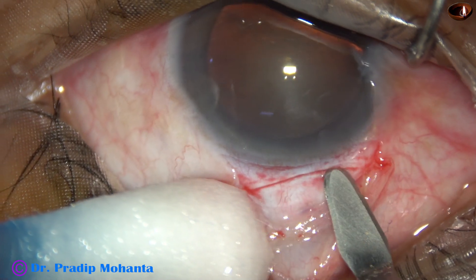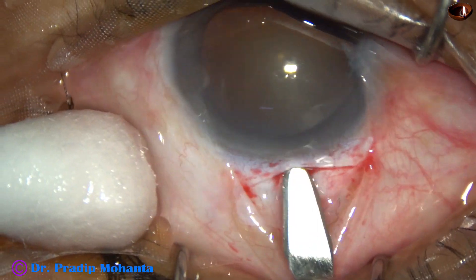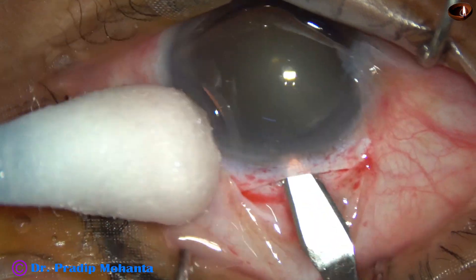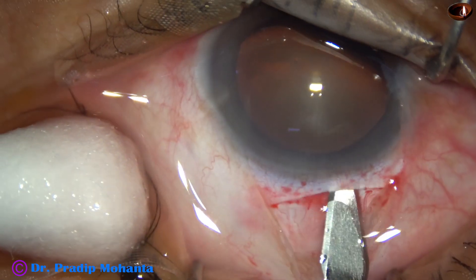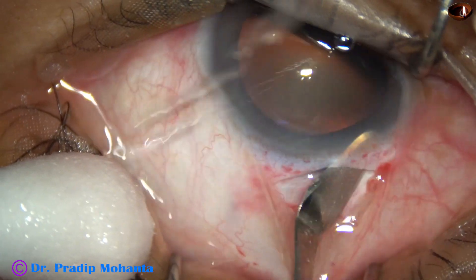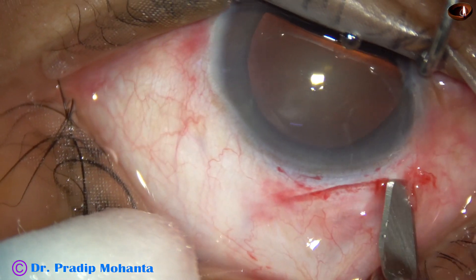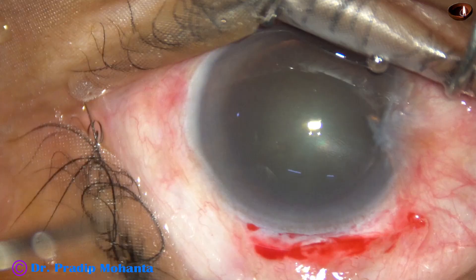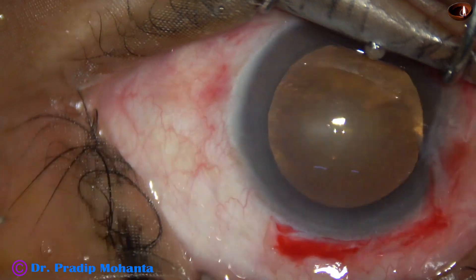Now a mild frown incision — the length of this incision is about 5.5 millimeters. We can make a smaller incision with this technique, but since this is the first case I am attempting division of the nucleus in SICS, I made this incision of about 5.5 to almost 6 millimeters through the main wound.